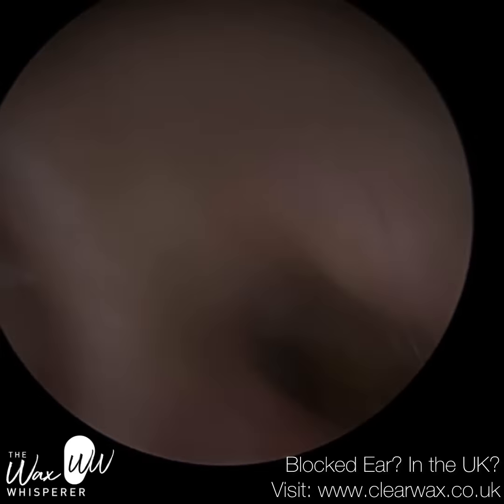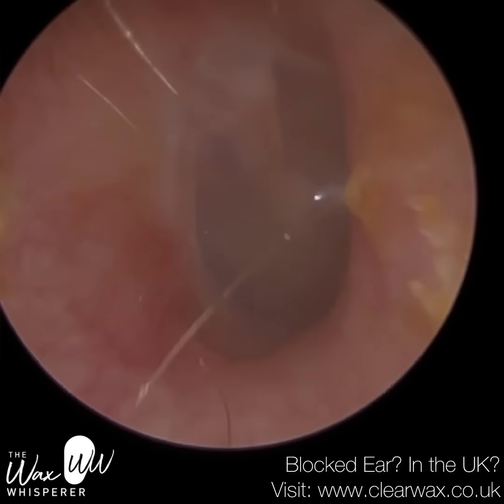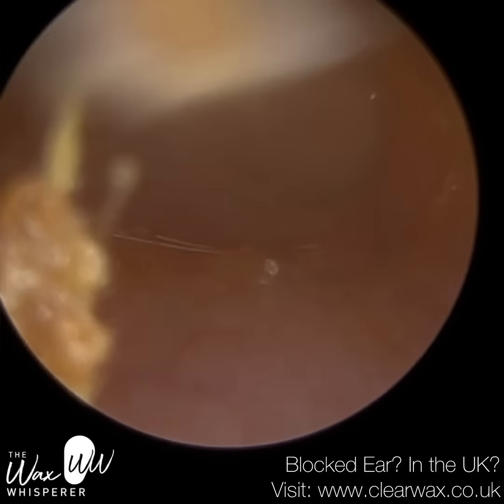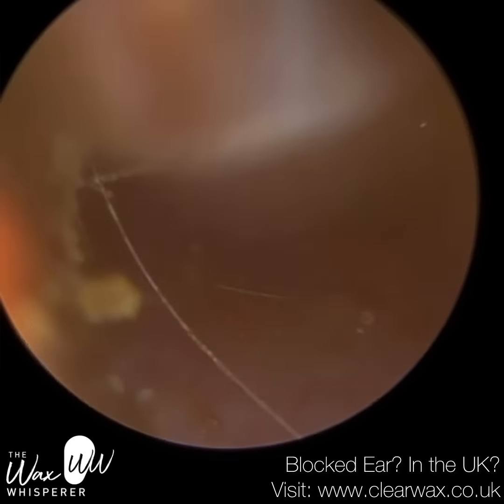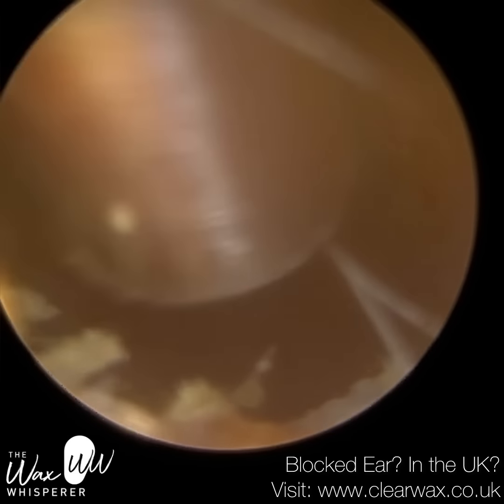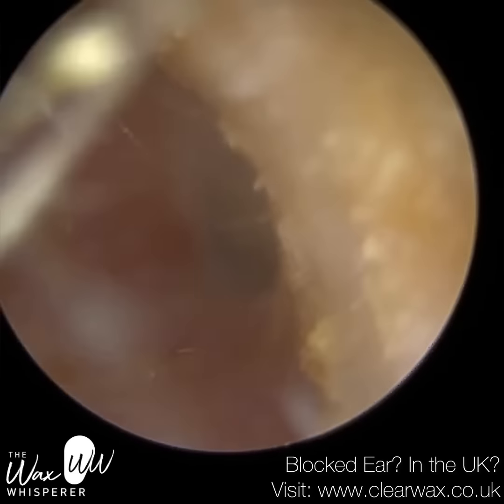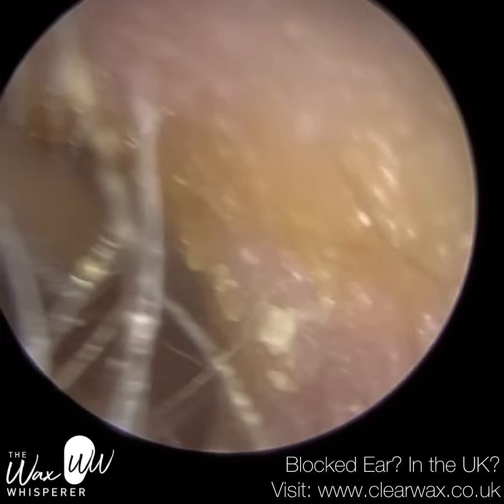So just mopping that up. Let me see the patient's eardrum — it looks textbook, really. There's bits and bobs around here that I'm just going to quickly mop up. A bit of wax is good for us. Wax is actually a combination of three ingredients. It's made up of dead skin cells of the epidermis layer — the outermost layer of skin — which is there as the protective barrier.